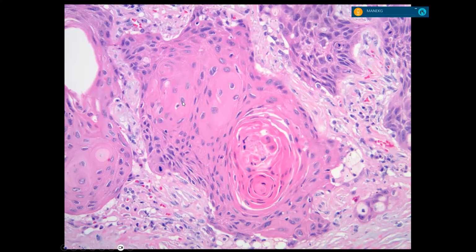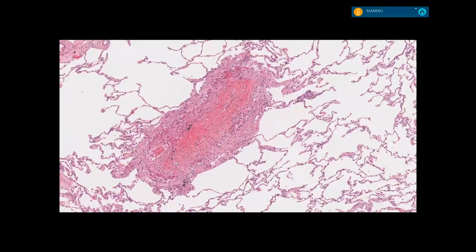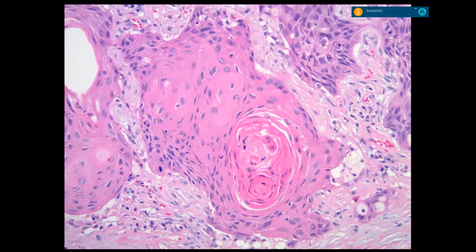And these are the tumor cells. The swirly thing is keratin. Anything that makes keratin and is malignant is a squamous cell carcinoma. These swirly things are keratin pearls. So keep that in your mind, okay? This is adeno. This is small cell. This is squamous. All right.